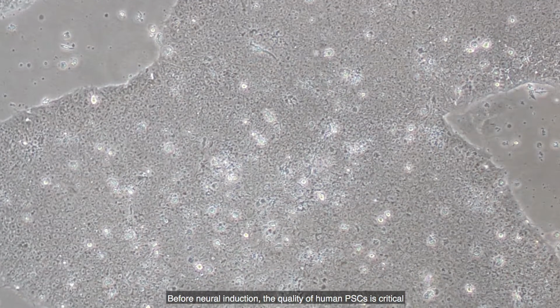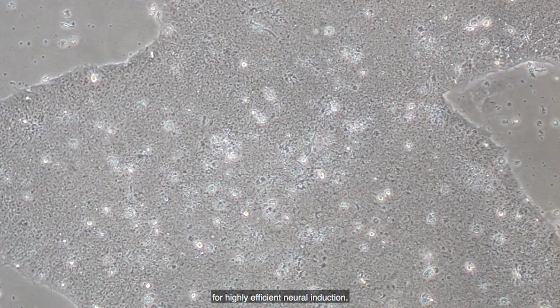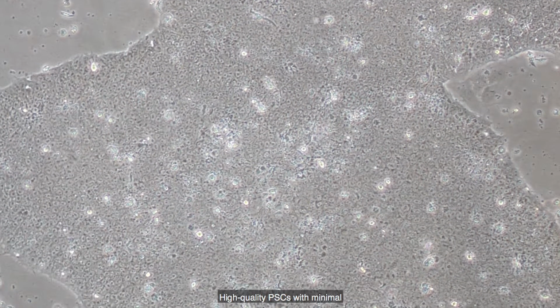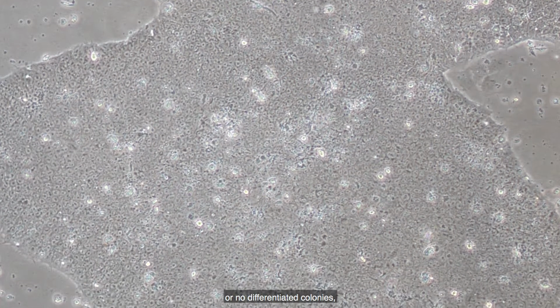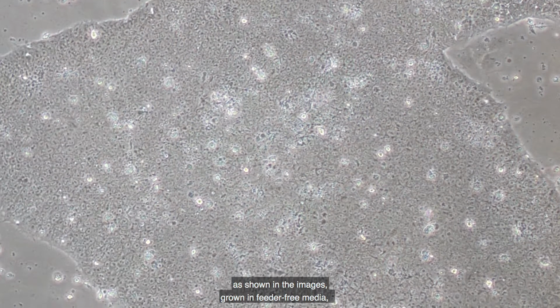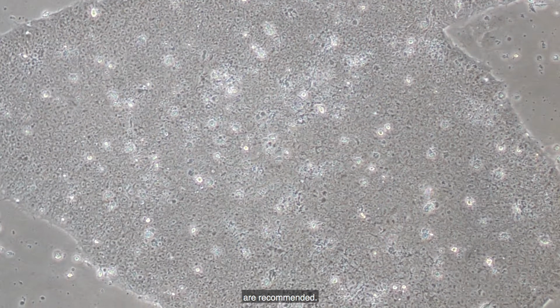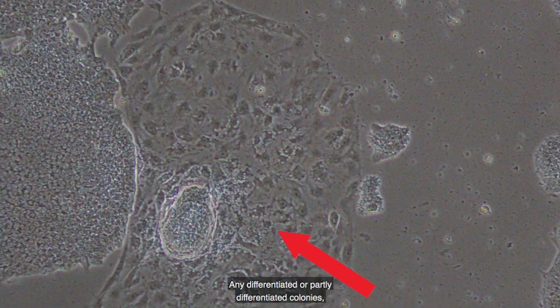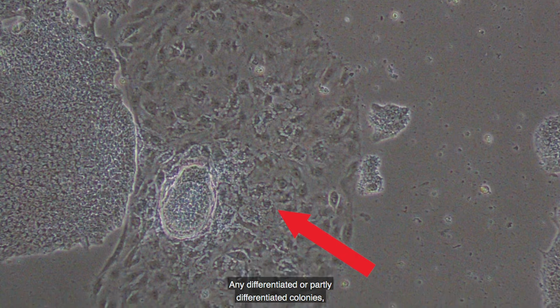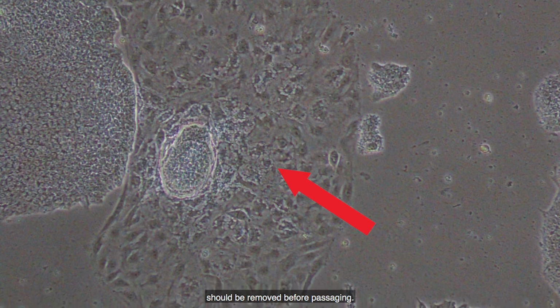Before neural induction, the quality of human PSCs is critical for highly efficient neural induction. High-quality PSCs with minimal or no differentiated colonies, as shown in the images, grown in feeder-free mediums such as Essential 8 medium or StemFlex Medium, are recommended. Any differentiated or partly differentiated colonies, as pointed with the arrow, should be removed before passaging.